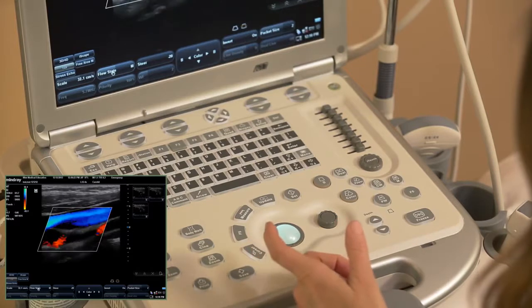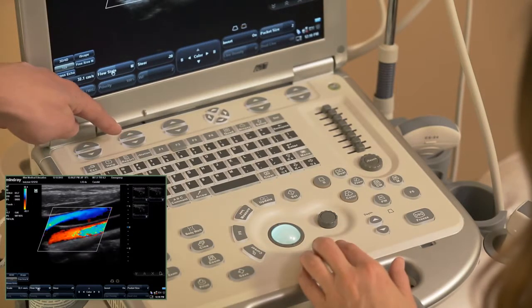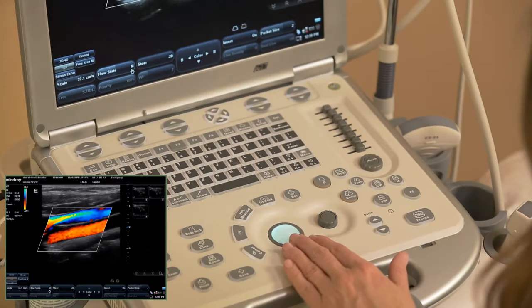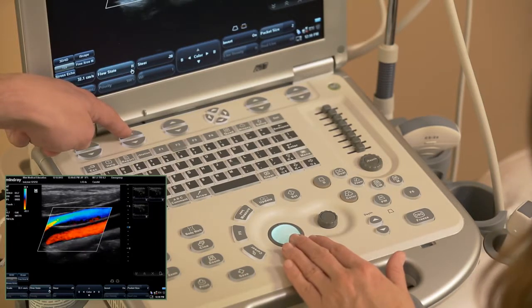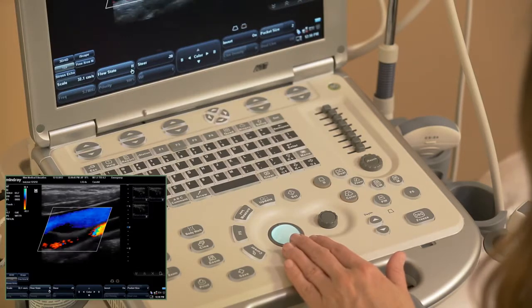So flow state. There's a couple of settings there. Again, the factory default should be very sufficient for what you're doing with the machine prior to having someone come work with you. But that will control whether it's a lower flowing vessel, like slow flow. Correct. Yep, and then you can go up to high as well. And really, again, the factory settings are good. You're pretty good with that.